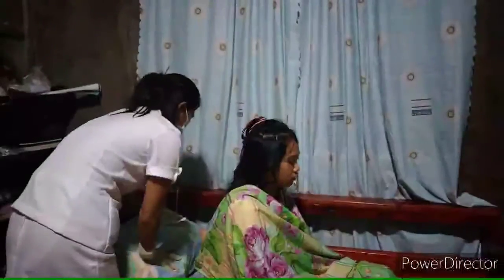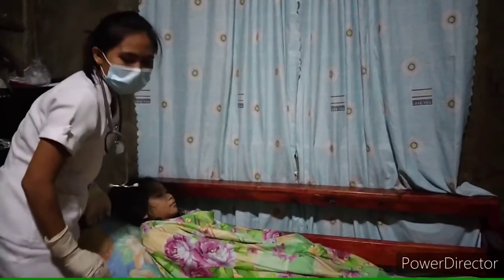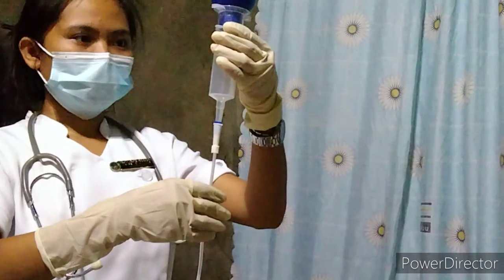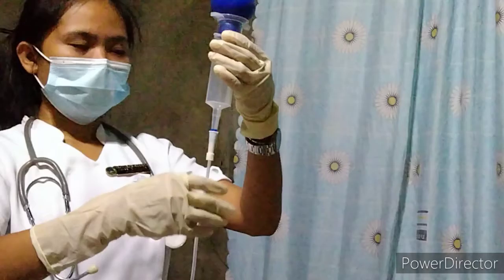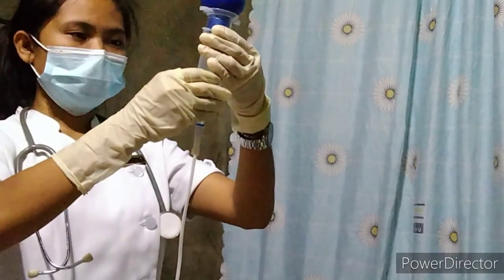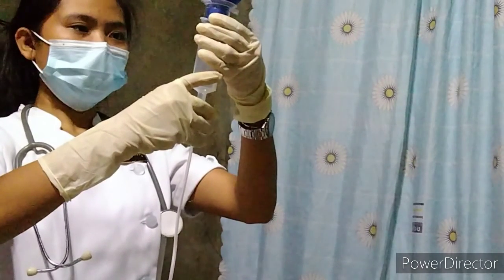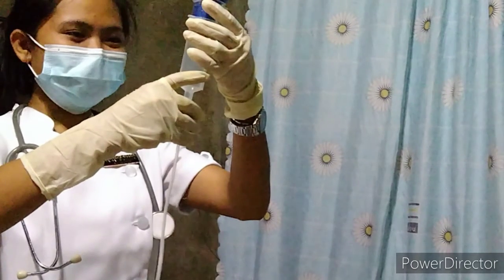Place client in high Fowler's position or elevate head of bed 30 degrees. Elevated head helps prevent aspiration. Fifth, determine tube placement. Aspirate gastric contents to check for gastric residual. Return aspirated contents to stomach unless the volume exceeds 150 ml. Rationale: presence of gastric secretions indicates that the distal end of the tube is in the stomach. Residual volume indicates if gastric emptying is delayed. Delayed gastric emptying may be reflected by 150 ml or more remaining in the client's stomach.